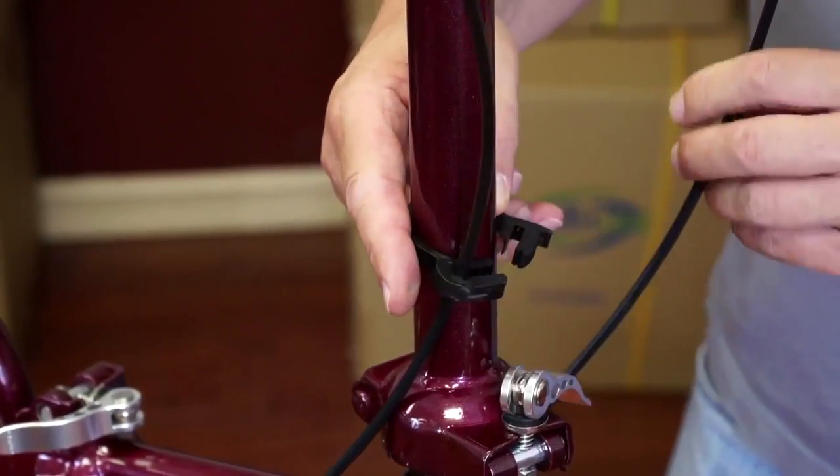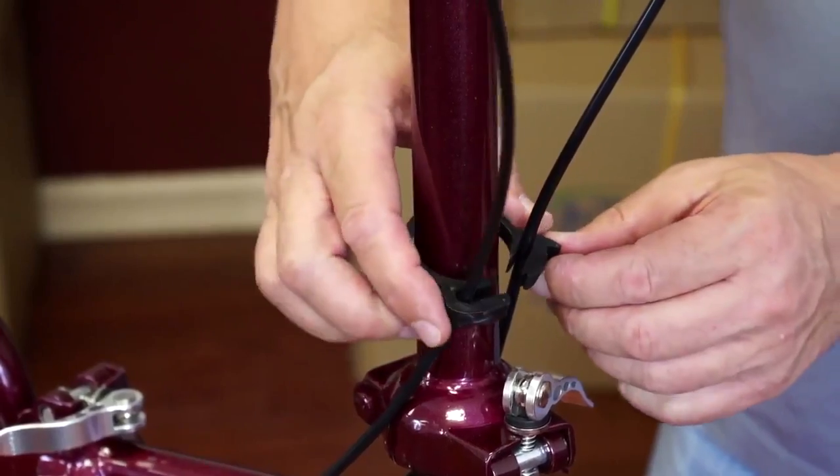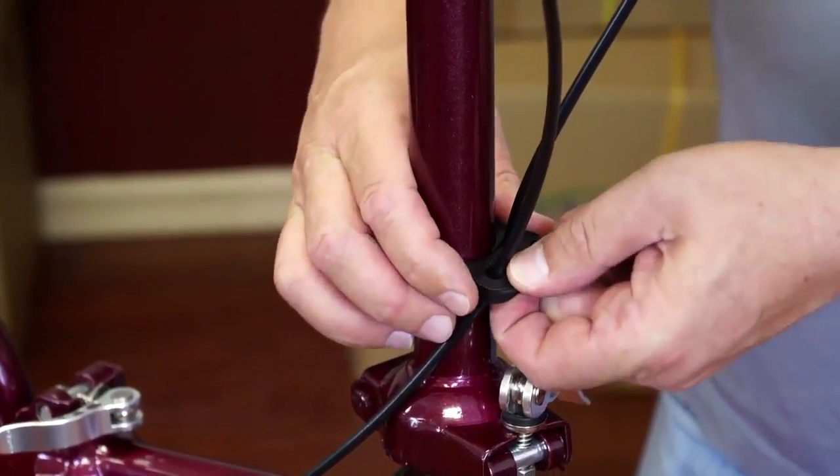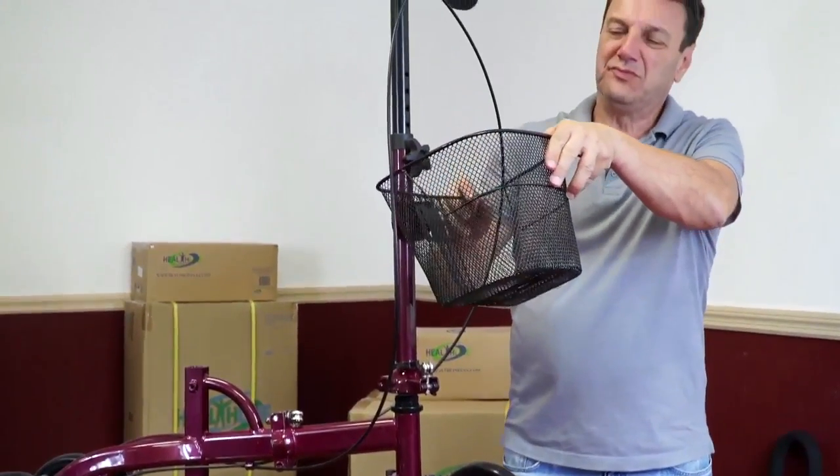Secure the brake wires on the front of the head tube with the plastic tie as seen on the video. Close the clasp. Hang the wire basket onto the plate welded to the front of the head bar.